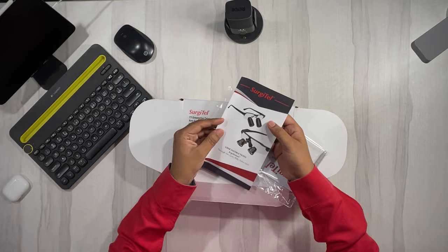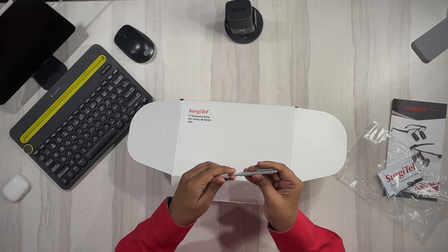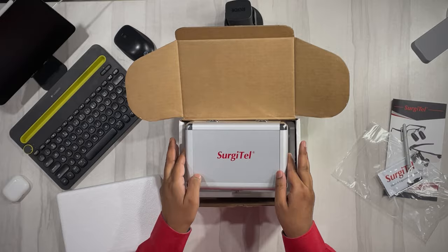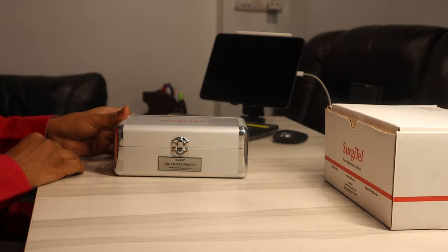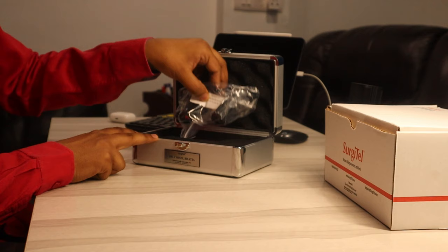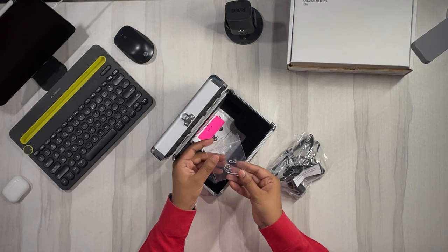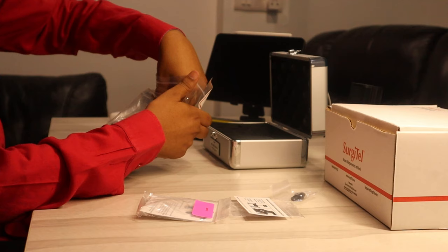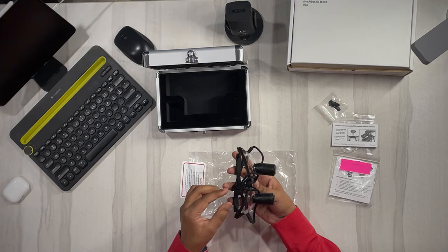So when you open the box first, you are greeted with an instruction manual. Along with that, you have a cleaning cloth and a pen-like instrument, which is nothing but a screwdriver. This screwdriver is to be used when you want to replace the extra nose pads, which are provided in the box. Then you see this beautiful aluminum box with Surgitel branding on it. And under the box, there are some more instructions. On opening the aluminum box, you are greeted with the first look of the loop. There are some extra nose pads and some more documents and instructions.